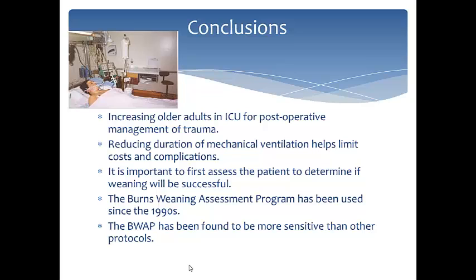The comprehensive weaning checklist and scoring instrument has been in use since the 1990s. The BWAP has been found to be more sensitive than other protocols in determining whether a patient is ready to be weaned from mechanical ventilation.